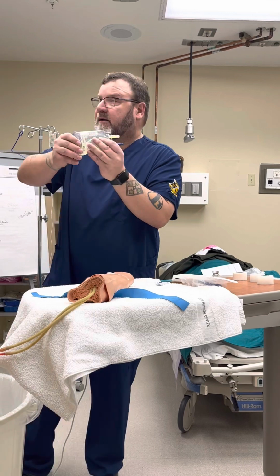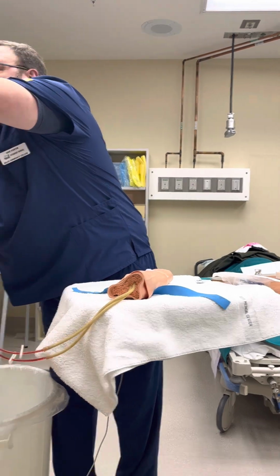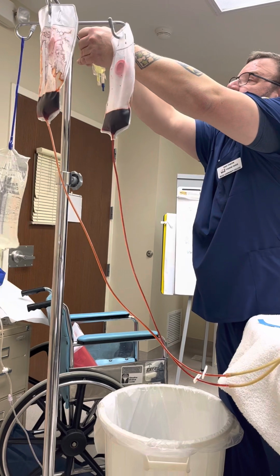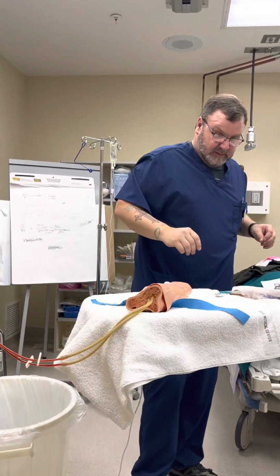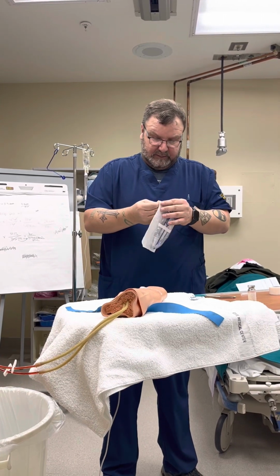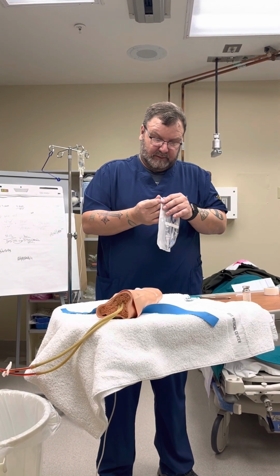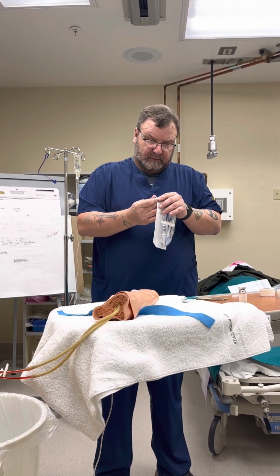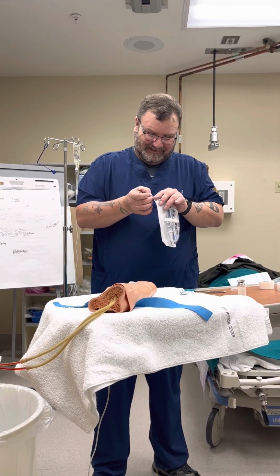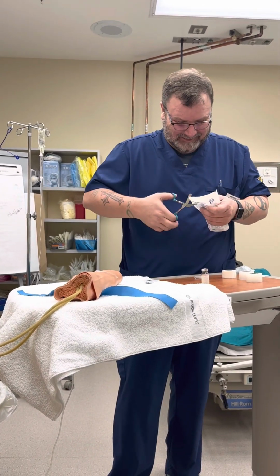And so now I need to move my main line down, and I'm going to hang my piggyback up. I'm going to take this administration set and get it open. Use the scissors. Yeah, there's some scissors here.